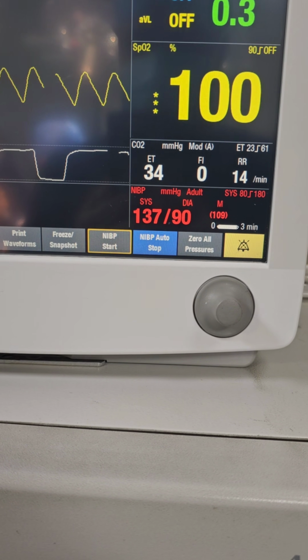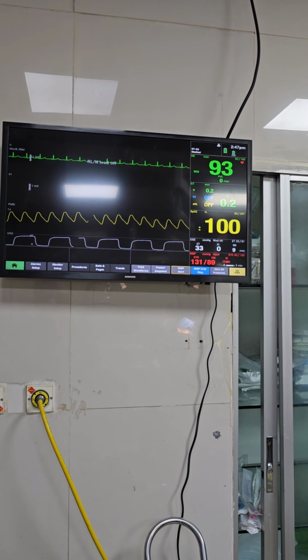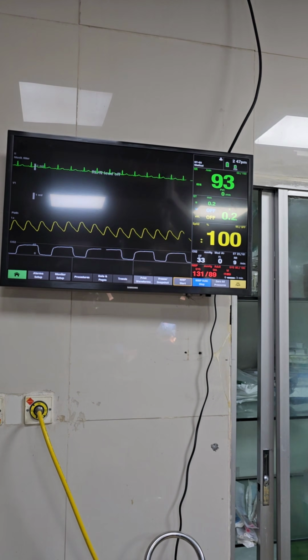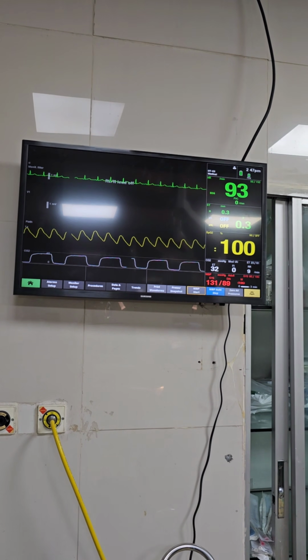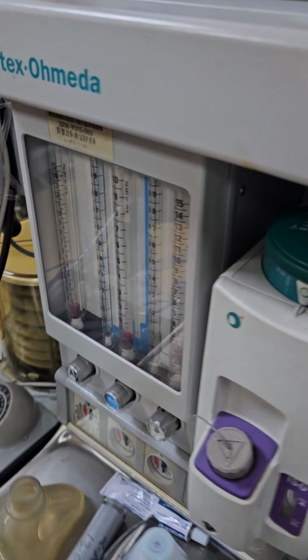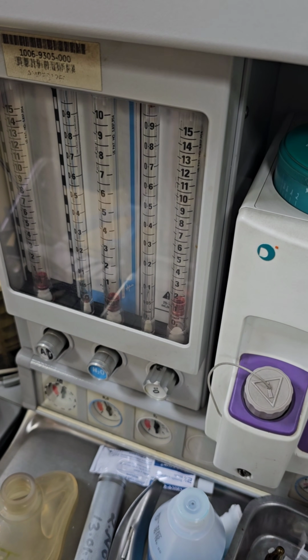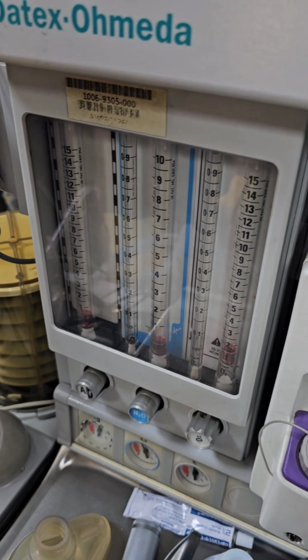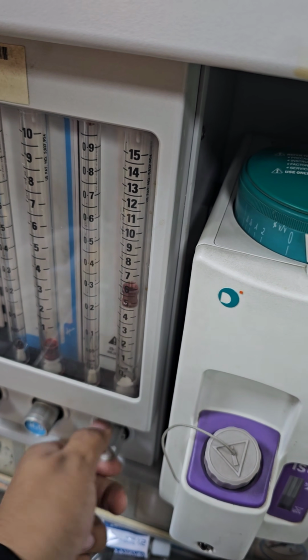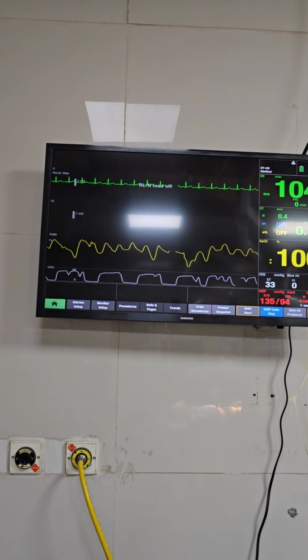Make inspiratory hold. We are seeing the hemodynamics already is a very perfect scenario for reversal, and we are ready for reversal. Maybe we start the oropharyngeal suction right now to check for any secretion inside the patient, and we stop the nitrous and increase oxygen to wash out all the carrier gases, nitrous, to give the patient more oxygen filled in her lungs.